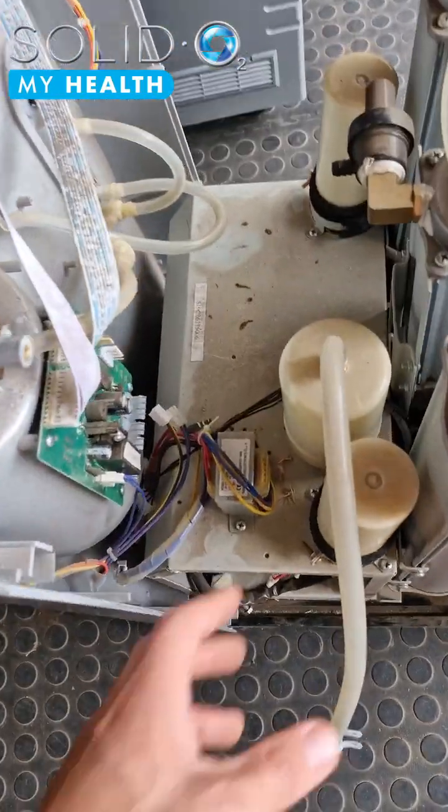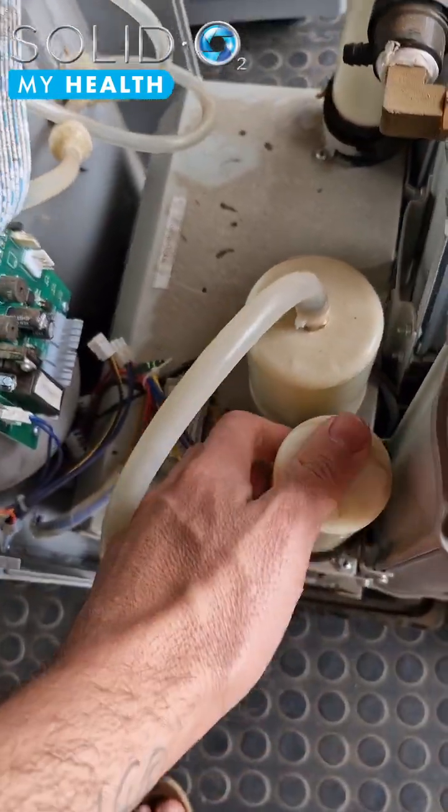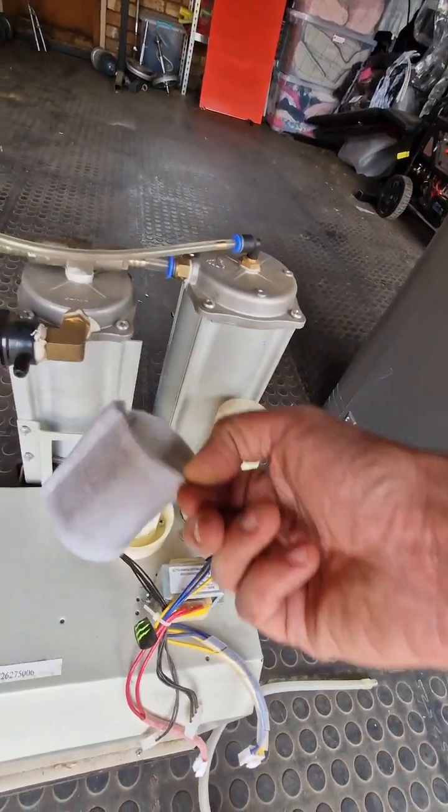Back to your HEPA filters. So you need to find the inlet pipe of your compressor. Usually this is quite easy to find. You might need to remove a cover to see where's the inlet of your compressor. Just follow the piping. You're going to find there's a place where your compressor pulls air in and you want it to be going through a HEPA filter that you're going to replace. As you can see in this video, I simply unscrew the casing, replace the HEPA filter and screw it back in.